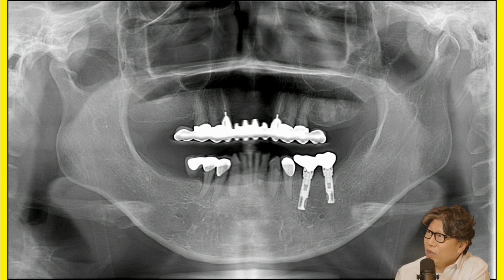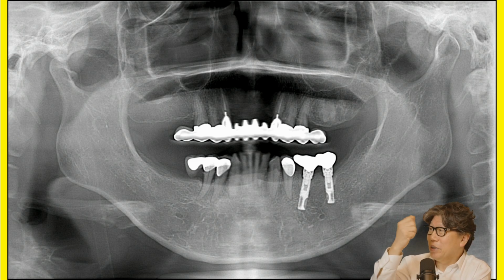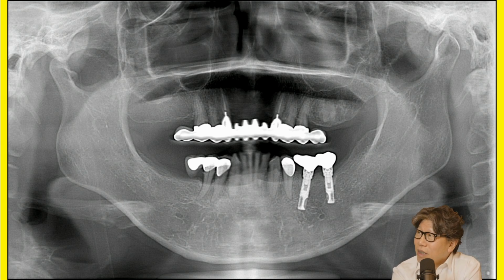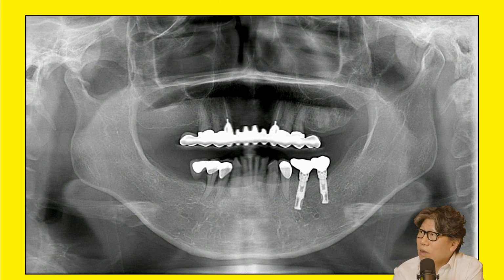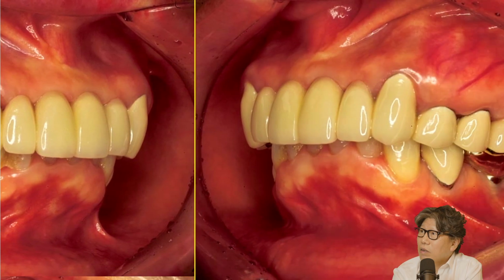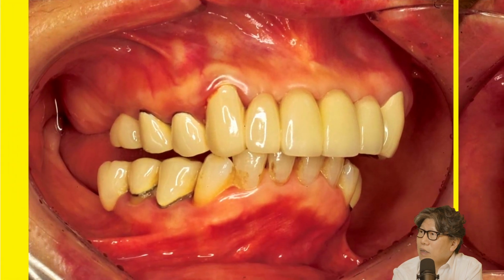This is what happens when you move your wrist like this. When you're planting, you're supposed to plant with arm movement like this, but if you plant with wrist movement, it becomes a pickaxe. What was it then? 3.75 millimeters in diameter, and I planted the longest one I could. That one lasted a long time. It's not pretty, because it's a little bit in a bad position and orientation, but this one lasted quite a while. This is the follow-up until recently.